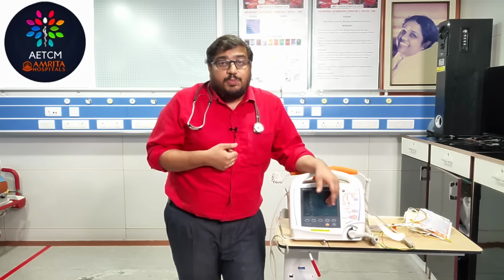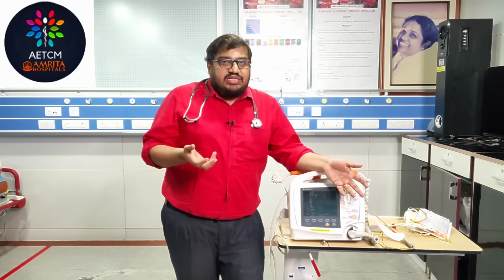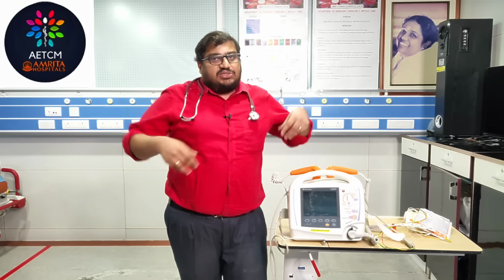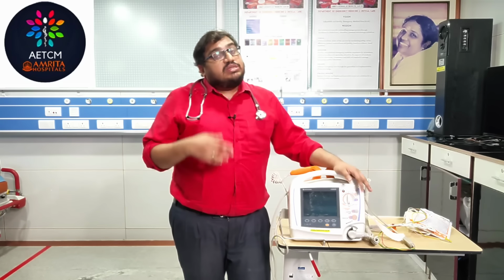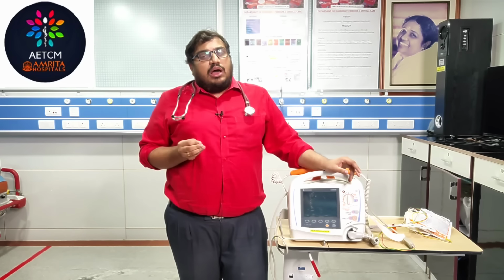Suppose this patient is on prone ventilation. In the COVID scenario, sometimes the patient might be on prone ventilation. At that time, what do you need to do? You can keep the paddles on both sides of the axilla. So you can use these adhesive paddles. That is better in case of prone ventilation. So these are the positions where to keep your paddles.